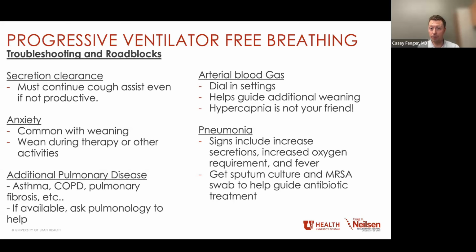Anxiety is a big part of this. A lot of these patients have been on ventilator support for weeks, and so taking that support away can be really disconcerting to them and anxiety provoking. A lot of them feel like they can't breathe, they can't catch their breath, almost like they're underwater. So we'll try to actually wean during other activities. So when someone's doing OT or speech, PT, maybe a rehab psych session, doing something to distract them from the fact that we're decreasing their ventilatory support.